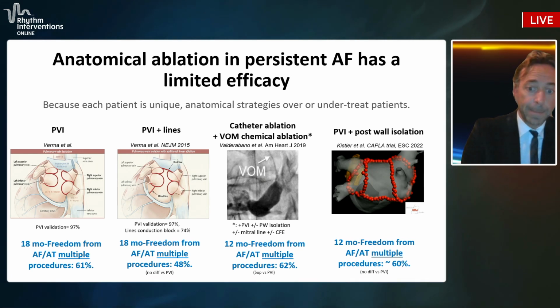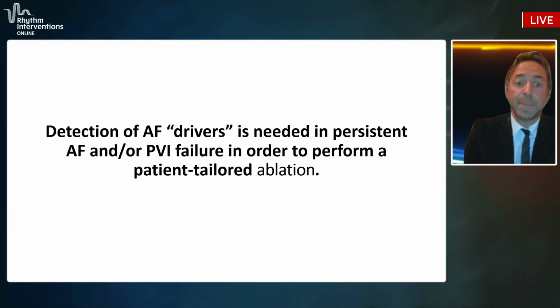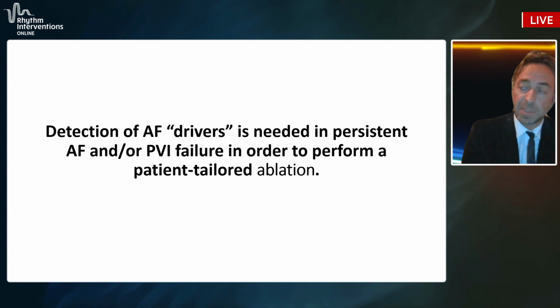That is why the detection of AF drivers, in my opinion, is absolutely needed in persistent AF and/or in case of PVI failure, in order to perform a patient-tailored ablation and to adapt our strategies to each patient's substrate.